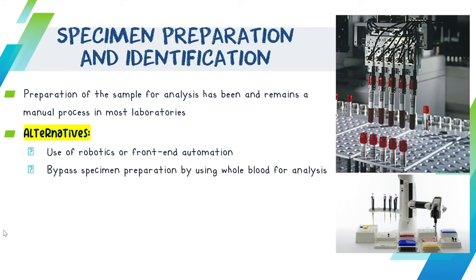So, in order na ma-lessen or ma-cut off na siya na time, then it would be best to use a whole blood analysis. But naaman po tayo pros and cons with the use of your whole blood. Kaya naaman po tayo uban substances sa ato ang body na mas gwapo or mas okay ang iyahang levels kung dito mismo nato siya sa serum, kay mas present man siya dito sa serum compared to your whole blood. Though I could point out that there are really auto-analyzers as of the moment na naingani na ang ilahang ginatanaw na instead of using the serum, then we will be using whole blood.